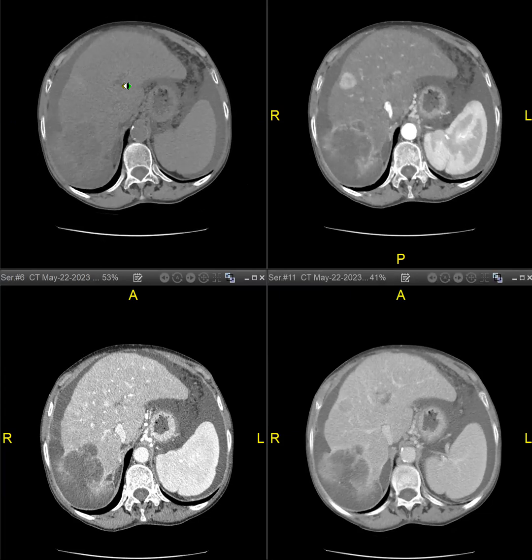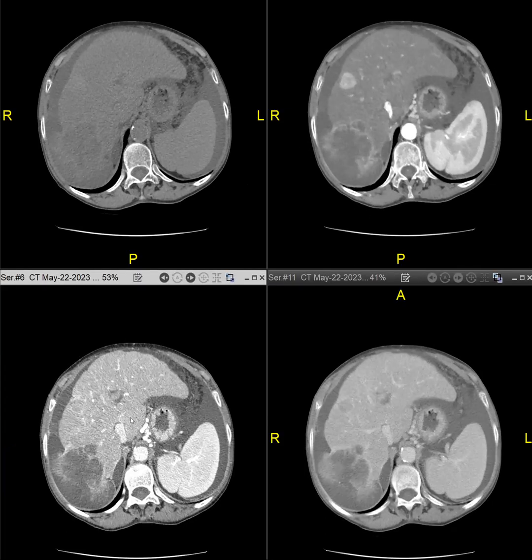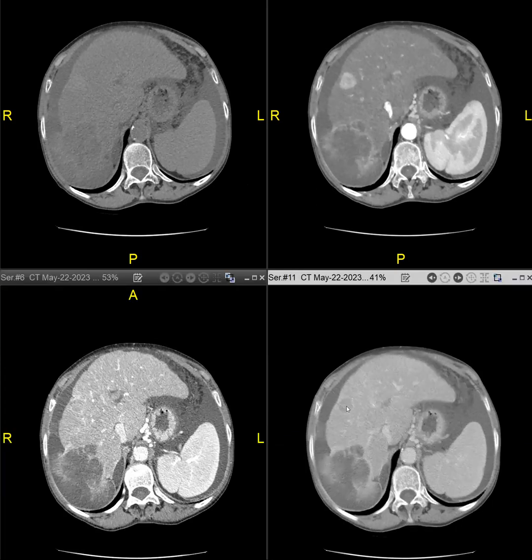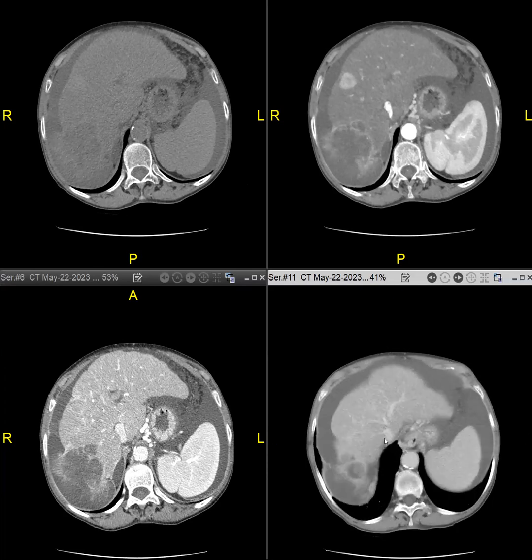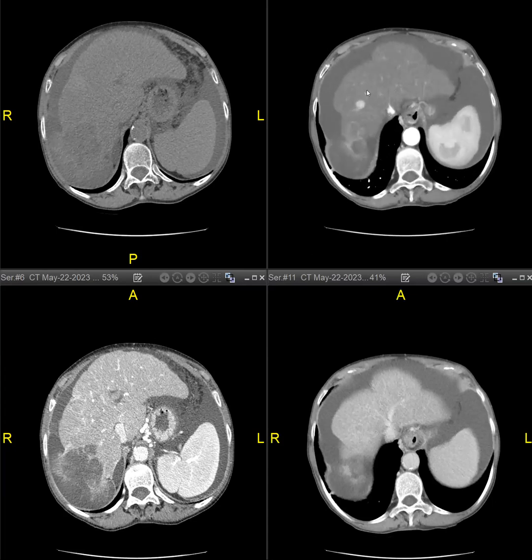And then there are two more lesions. You can see this one has non-rim APHE, it has washout, it has a capsule, it's over two centimeters, and the patient has cirrhosis. So it really has classic features of HCC — LR-5.